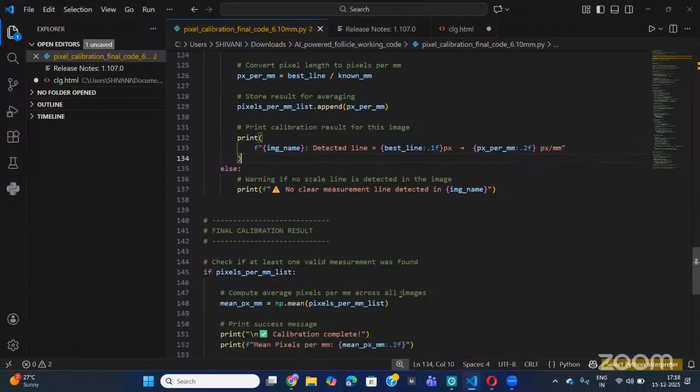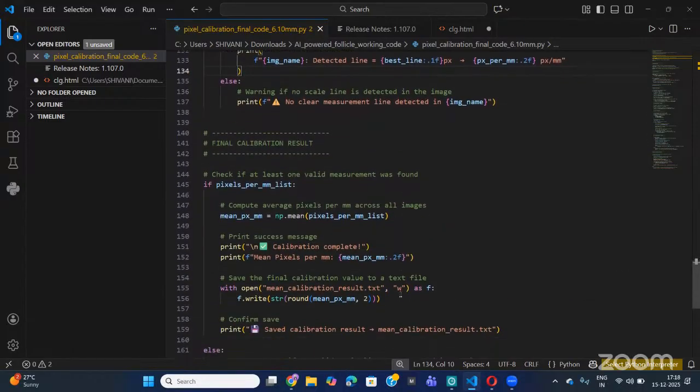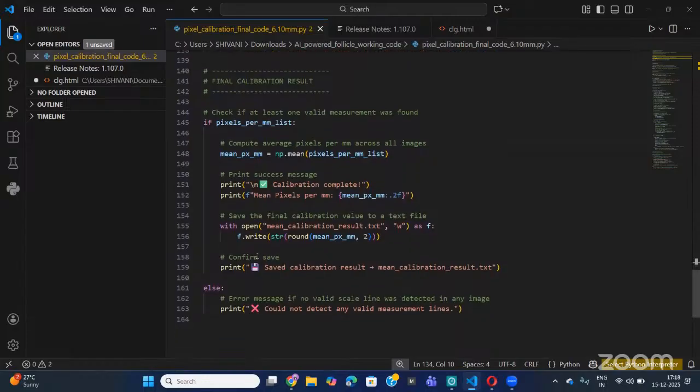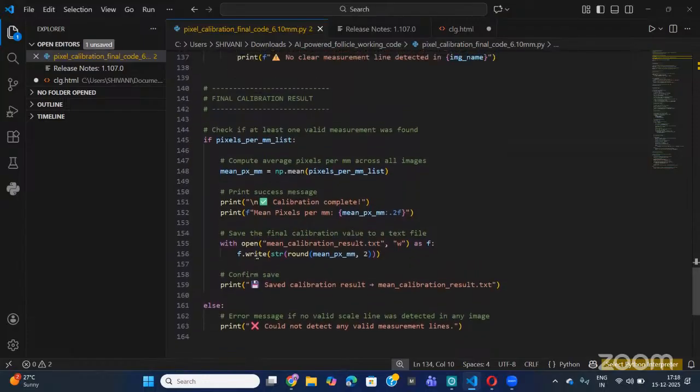The images were taken from the videos themselves and converted into frames. Those frames were pre-processed in RoboFlow, and then taken for measurement and detection.